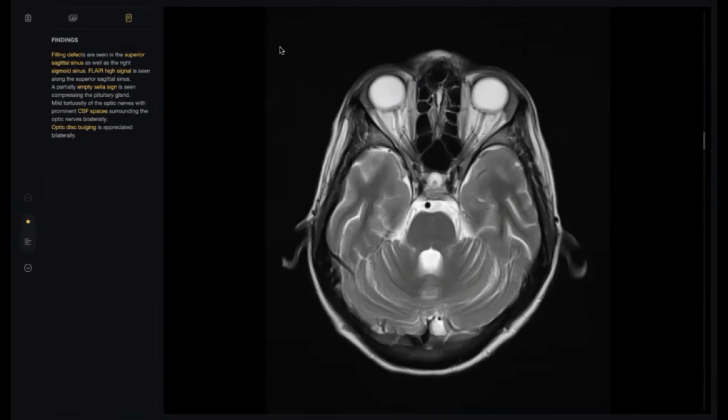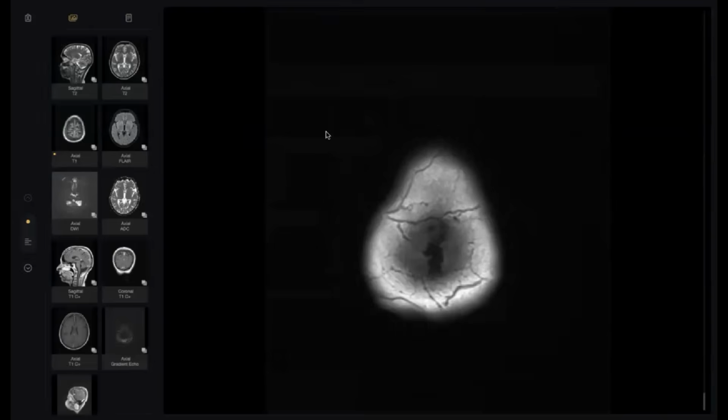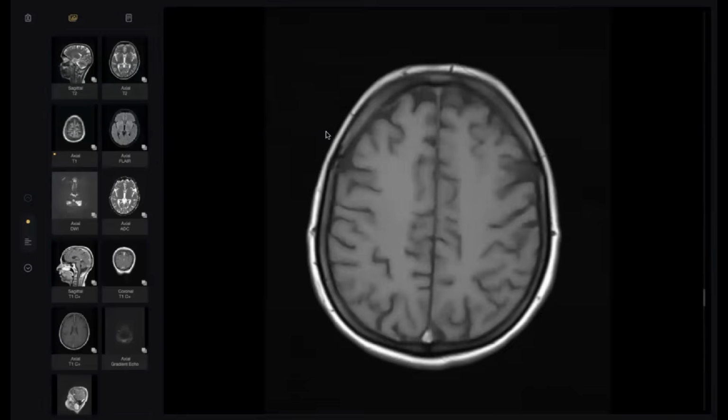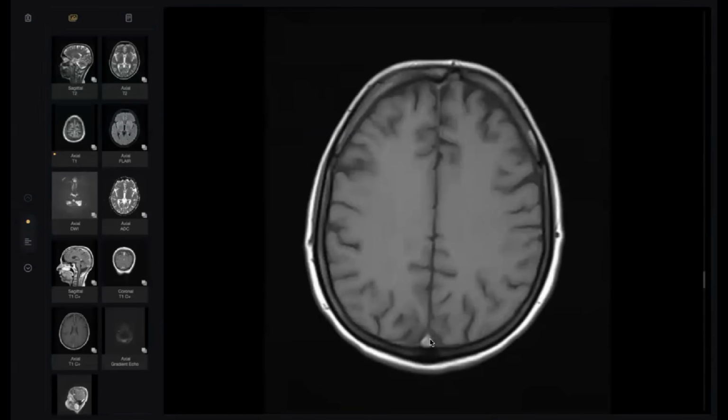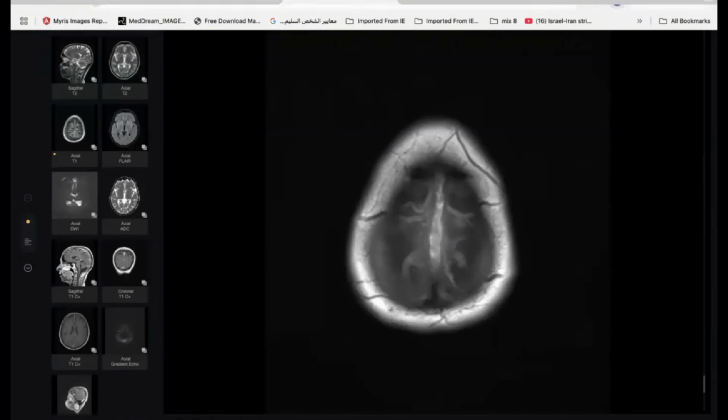At least tell the examiner, doctor, I am in doubt, I'm not sure whether this is IIH or not. I wanted to do CSF flowmetry. I wanted to do venography because in IIH the transverse sinuses are attenuated. What is the trick of this case? Two tricks really: the suspected IIH and the lesion here. See, in the last slice, here there is hyperdensity, and you can pick it up from here, but here it is very clear. Thank you, doctor, so much.